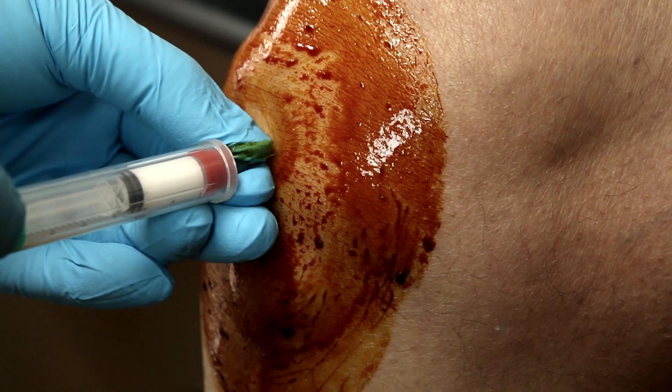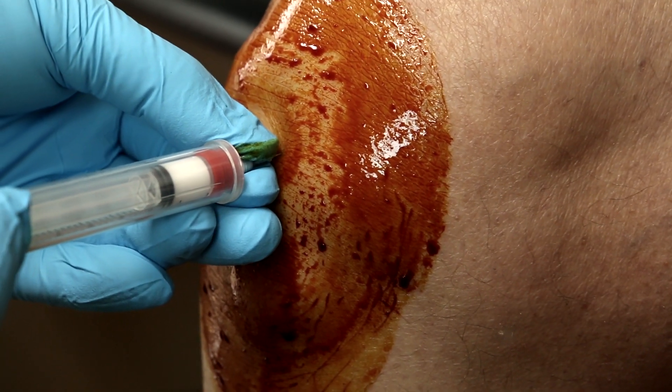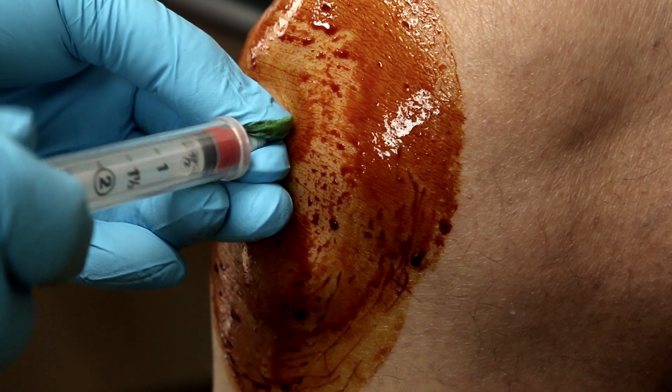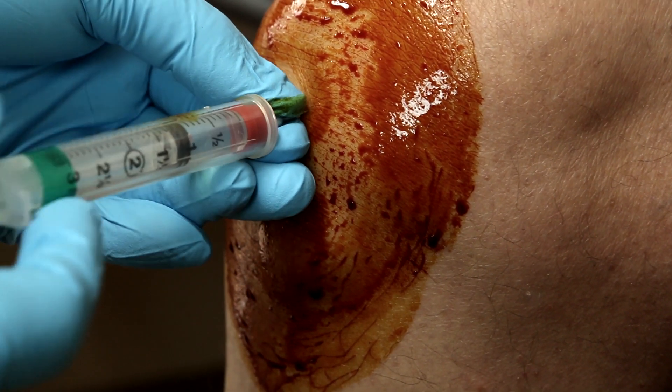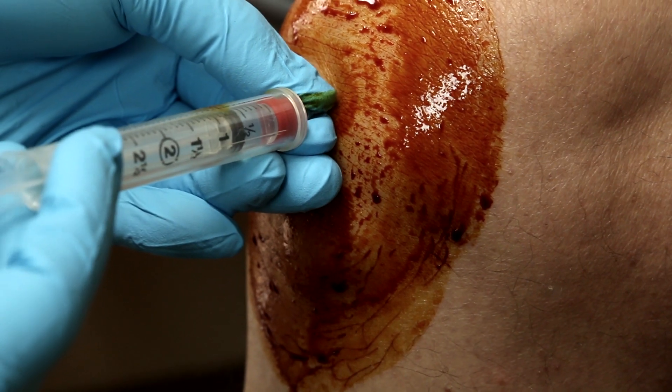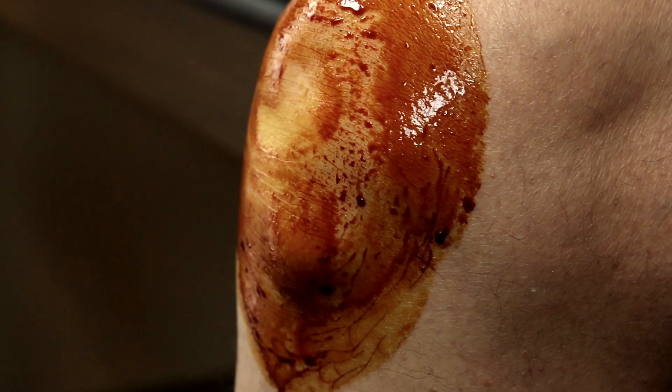I'm going to put in the cortisone. Methylprednisolone is what we're using. And that's it.